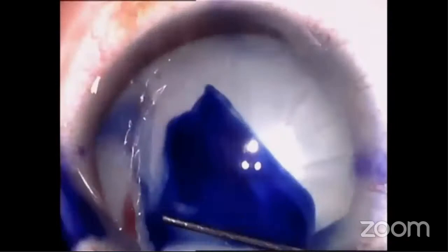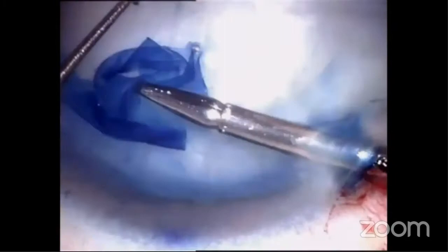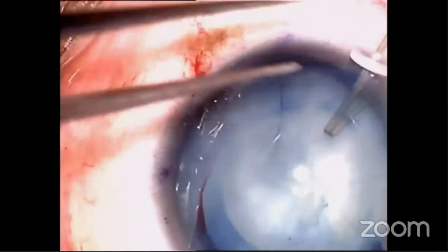The first thing to do is to remove this vitreous in the anterior chamber. We cannot phaco or aspirate the lens without doing so. Then we stain under viscoelastic with trypan blue. And you can see that I attempted a femtosecond laser, which did not cut through because I had not increased the energy for the femtosecond laser. And you can see now the rhexis is a little more difficult because first it's ectopic, but also because the zonules are weak.